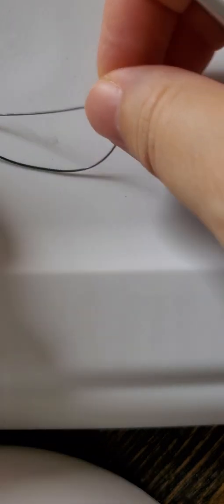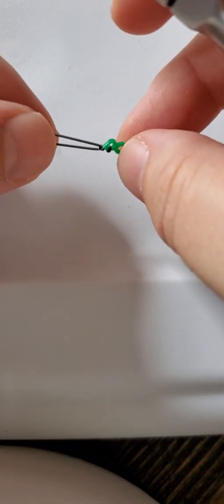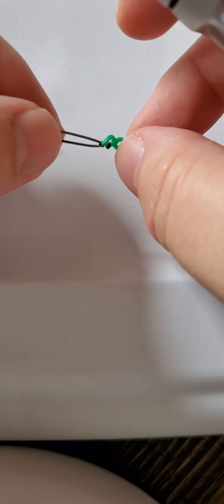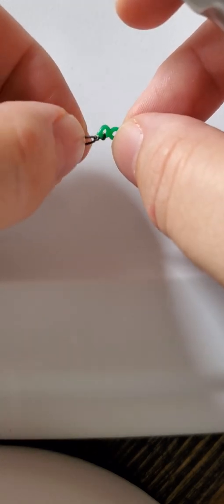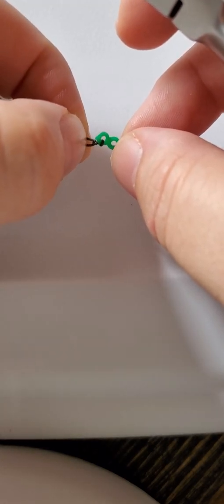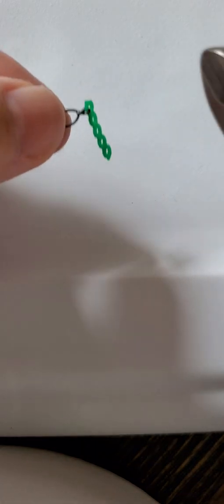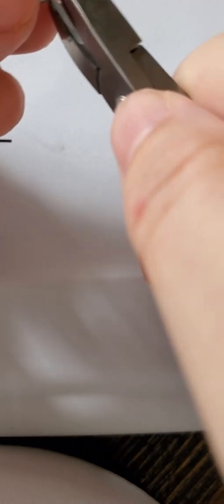After you tie it to the patient, you need to trim, obviously, the extra flash off of it. Make sure you're always leaving a little tail like that because if you don't, it completely unravels. So I'll kind of show you here.